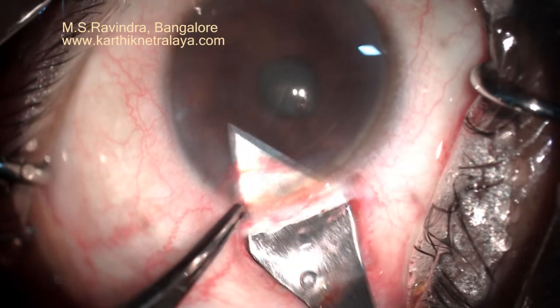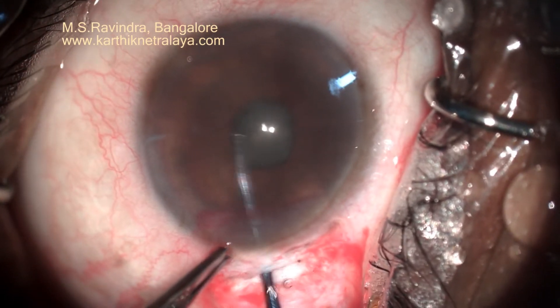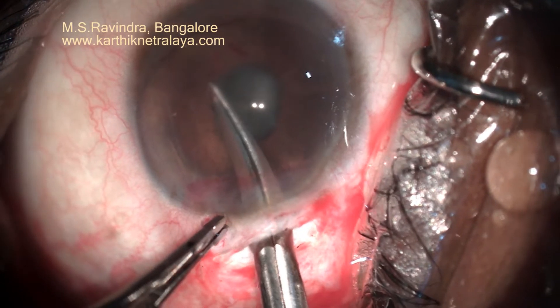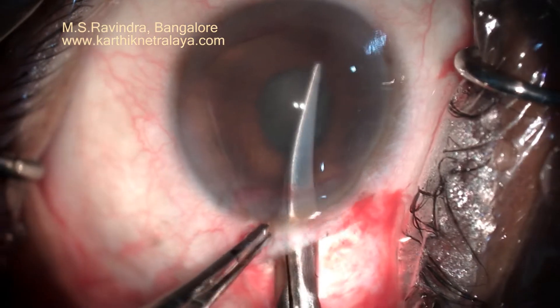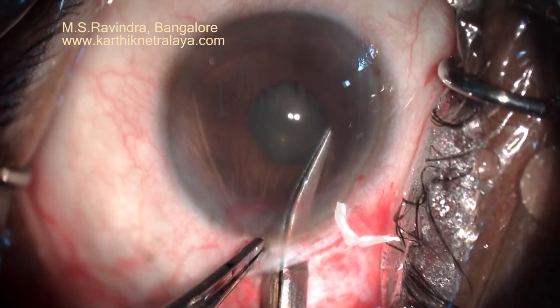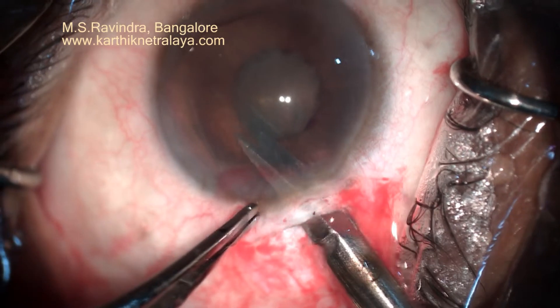I have enlarged the internal opening to about 6 mm and I am checking how much it dilates. The fibrotic ring and adjacent pupil are nicked with multiple Vannas cuts so that I can now do a stretch pupilloplasty. The other technique is to pull the membrane, which I tried in the other eye, but it did not come out.